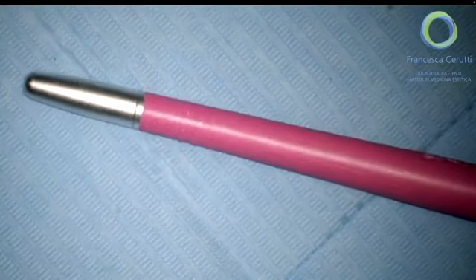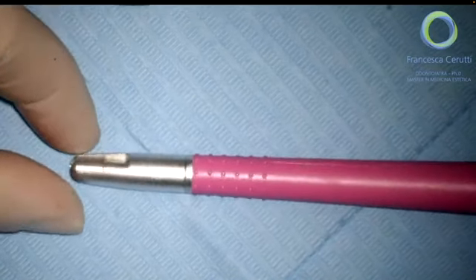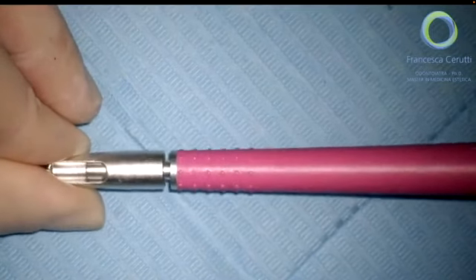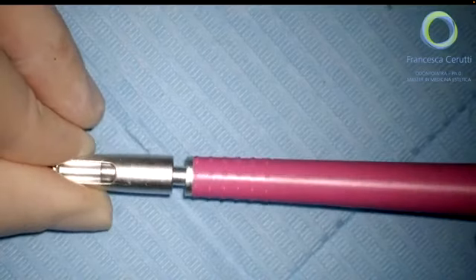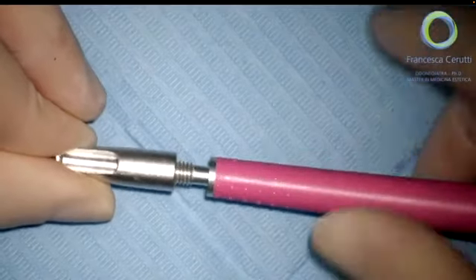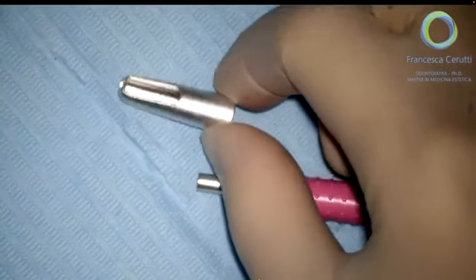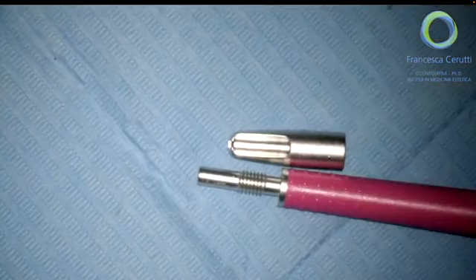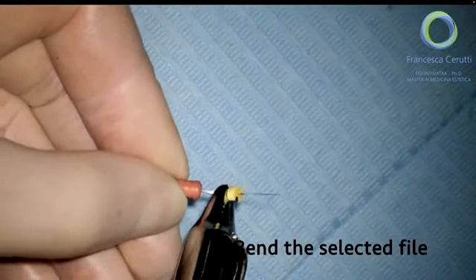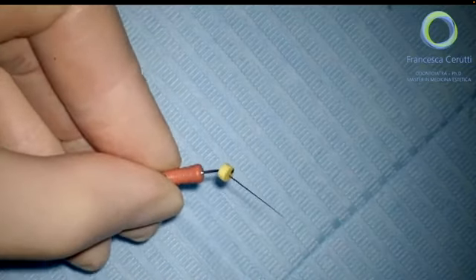So in this case, this kind of tool can really help us because as you can see now I'm setting it up, you just have to unscrew the tip of the handle, and inside of this handle you can put a manual K file, a spreader if you're using them, just anything small that can penetrate into the root canal. And when you are using K files, you can easily pre-bend them before putting them into the handle. In this case, you will not have to do it manually when you are working in the mouth.